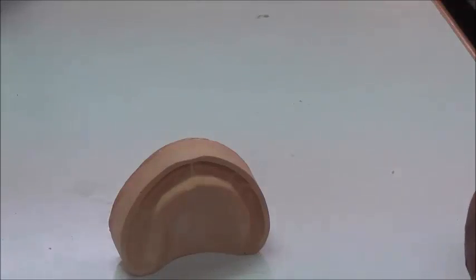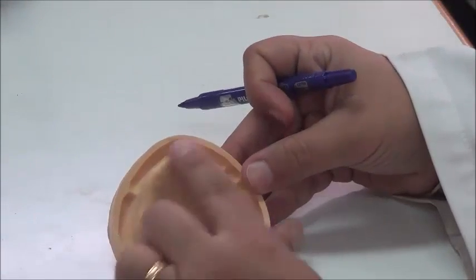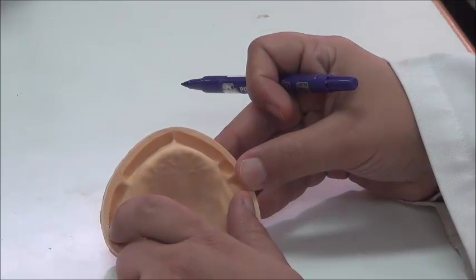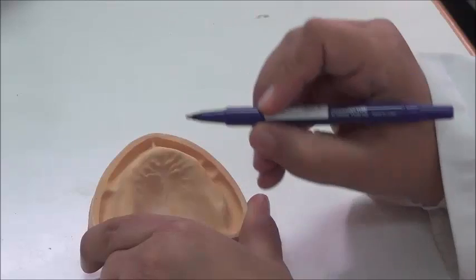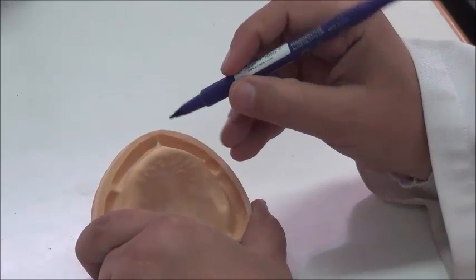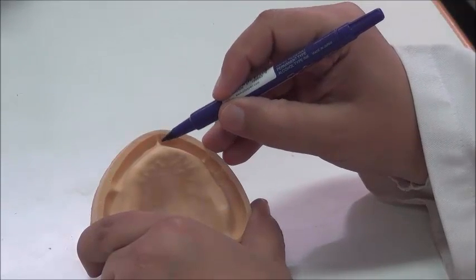So what we're going to do is first know what the midline point is in a cast, an edentulous patient, for example, because this will apply to this patient and many patients where you might be using arbitrary mounting. So what is the structure that is totally present in the midline? You might say it's the labial frenum.